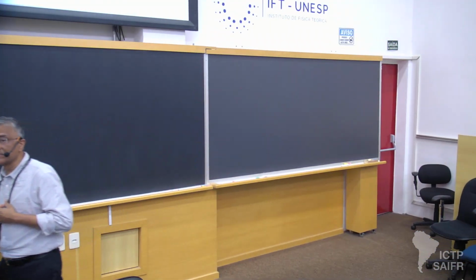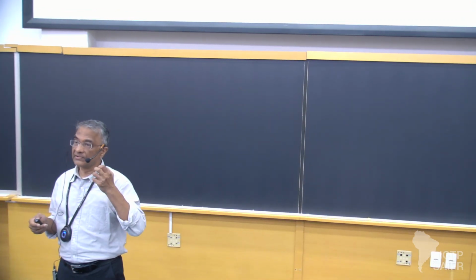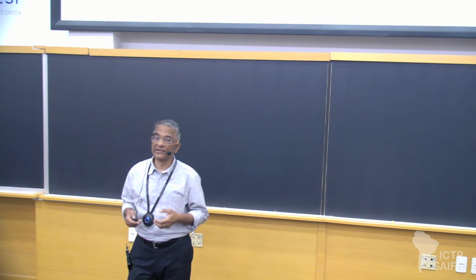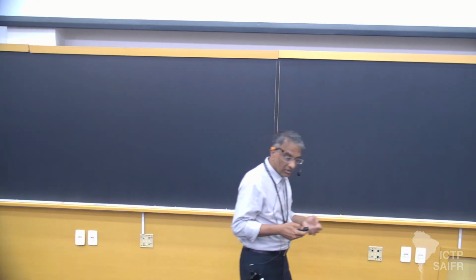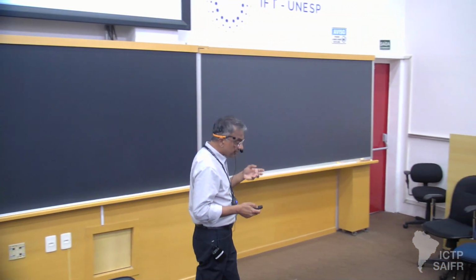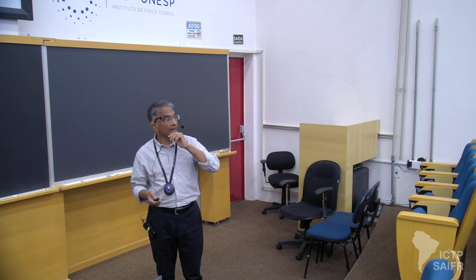One is for decision-making for epilepsy surgery. There are a number of things that we do to try and control seizures. For all of this, we need to understand where the seizure arises from, and then we go in and surgically either remove that part or otherwise put in a brain device to control it or ablate it in some manner. Another reason to monitor the brain is to be able to bring in closed-loop feedback control to control seizures as they occur.